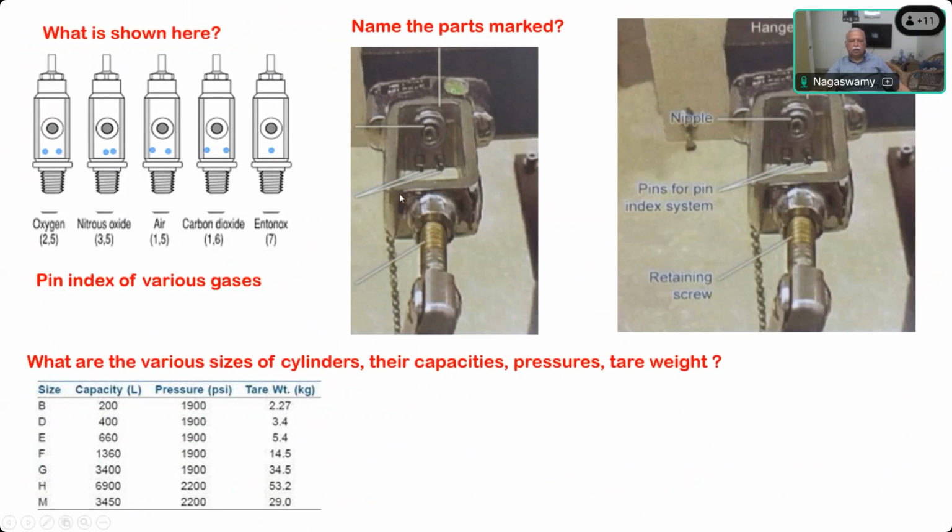So there will be a lever which you can tighten. That screw will go onto the back of the conical depression which I showed you in the earlier slide. So this screw goes into that to tighten it. So these are all the things with the hanger yoke assembly. Please remember that, because you are all used to workstations nowadays. You don't get an opportunity to see this, which is situated on the back side of the machine.